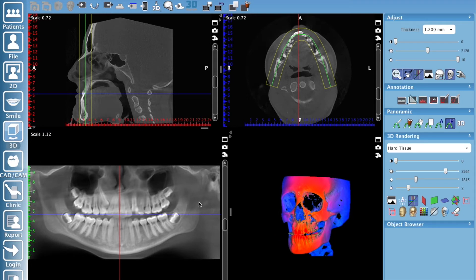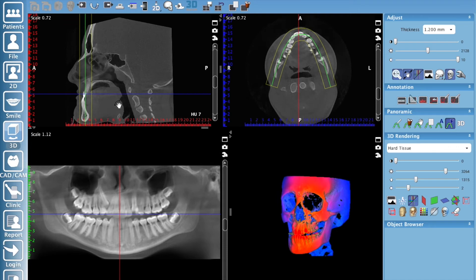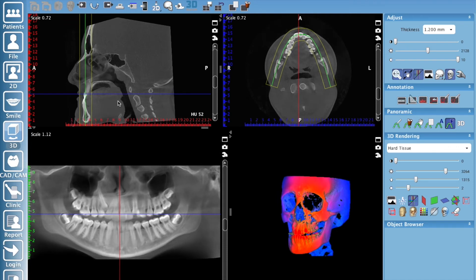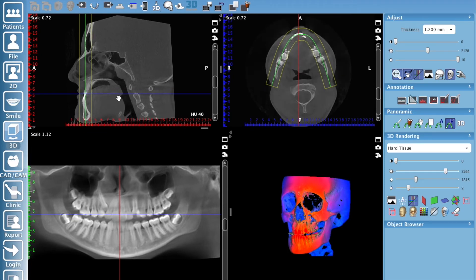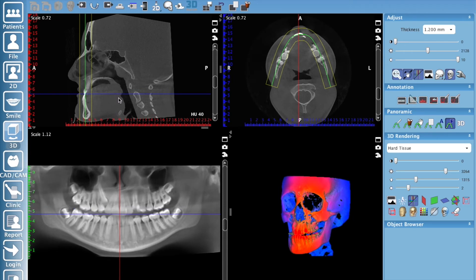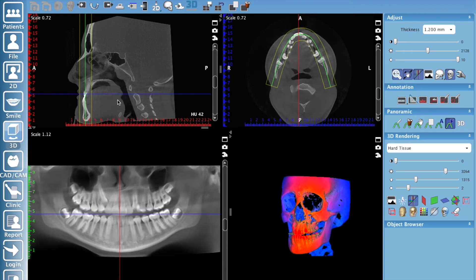I've got the image looking good here. Also, if you've got some radial lucency in the symphysis — kind of like pans will show a lot of times — maybe you need to tilt the actual volume. Go up to your sagittal view, right click, and then you can rotate it. You can change the curve speed, it's fully adjustable. You can move it up or down — so if the condyles are kind of cut off, slide that back down.